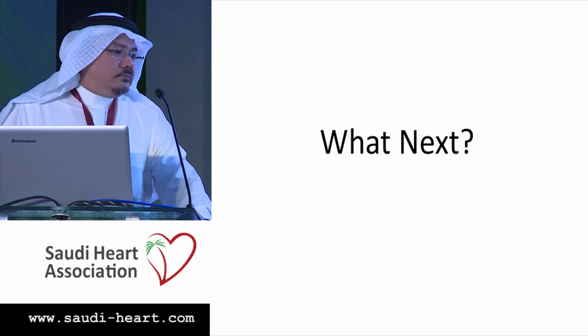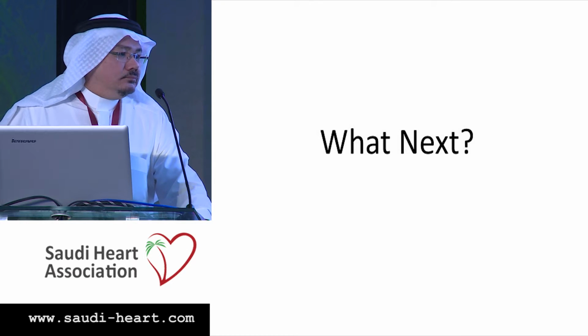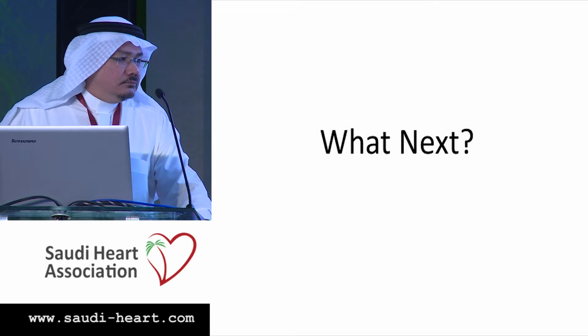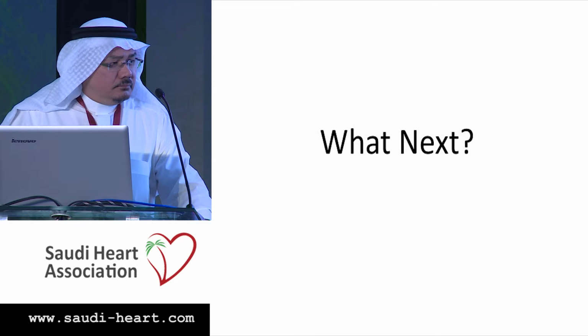Dr. Mohammadi, what would your approach be? Yeah, I agree with you. This is a good strategy. One other thing that I might think about is to give intracoronary TPA if it's available in the cath lab, and get another shot and see where we are. If there is not much improvement, then I would just send the patient to the CCU and re-angio again.